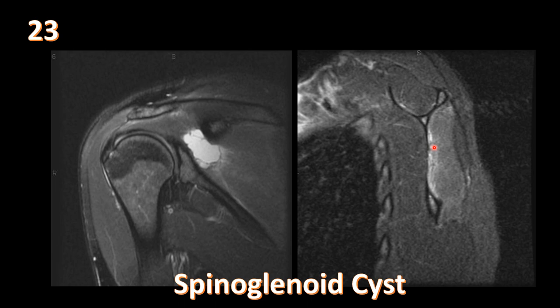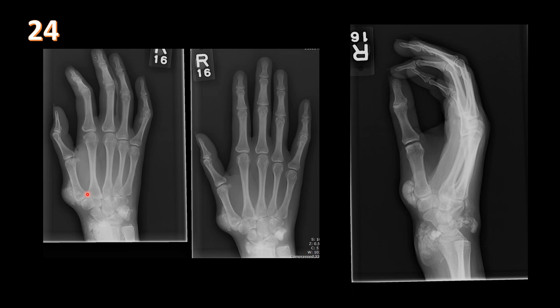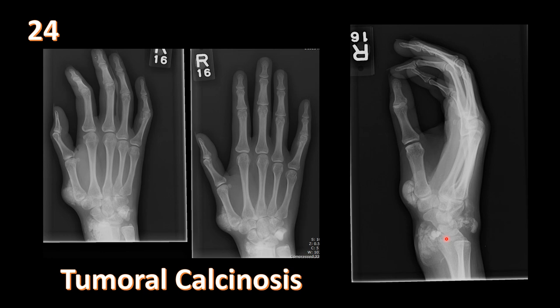Three views of the hand show clumped calcifications around the wrist joints. This is tumoral calcinosis, in the differential diagnosis of soft tissue calcifications. It typically occurs in young African-American patients, around articulations, and is idiopathic. The periarticular location and patient demographics favor tumoral calcinosis.